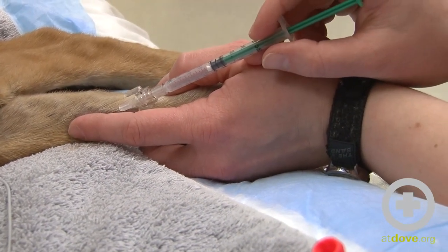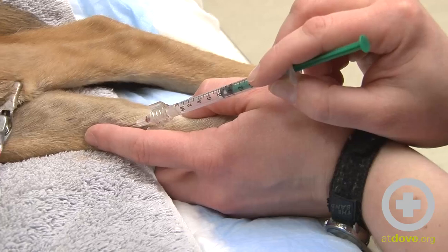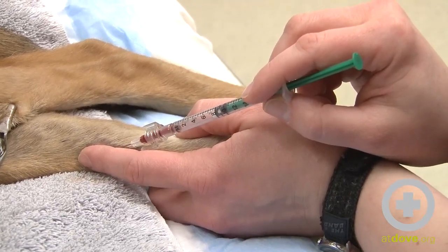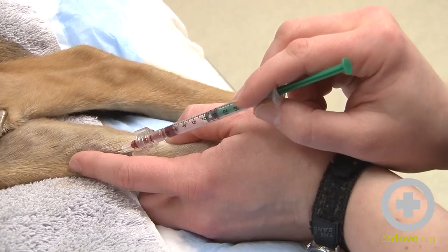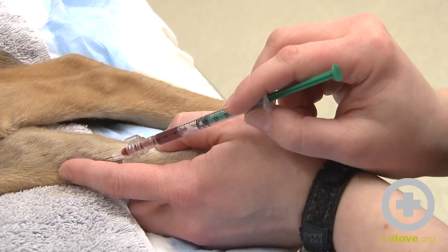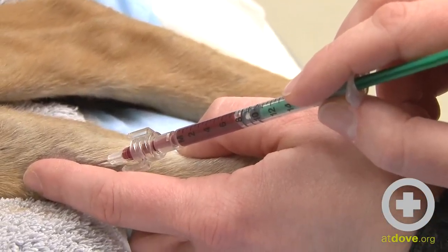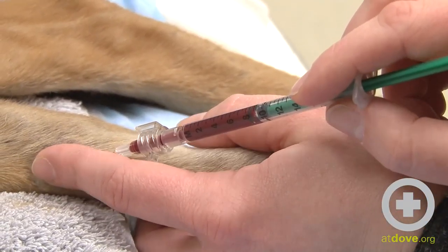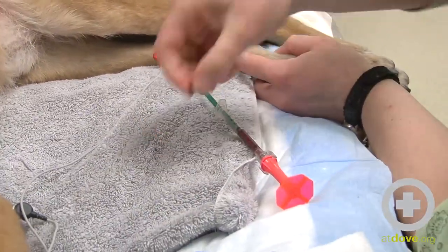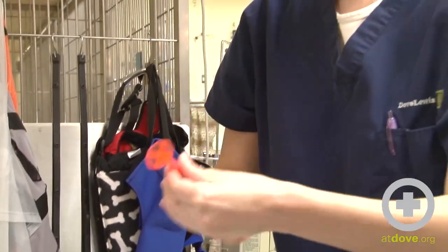There's a little bit of crunching — artery walls are a little tougher than vein walls, so you have to go through those. Now the trick is just to hold really still. You can see that it is self-filling the syringe. When I remove the needle, I'm just going to put pressure over this artery with my left hand that's already on there. I'll pull out immediately into here. I've got Meredith here and she's going to immediately take that and run the sample.